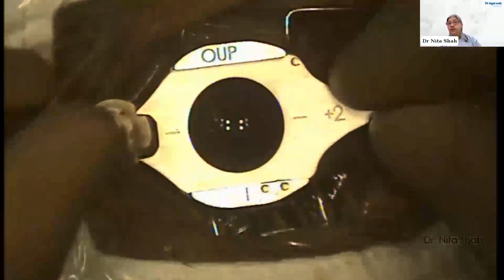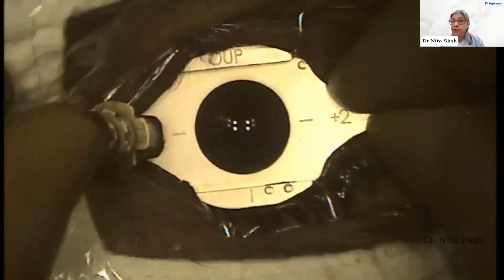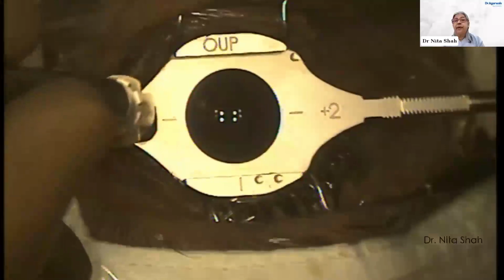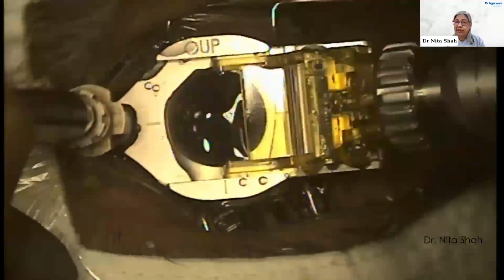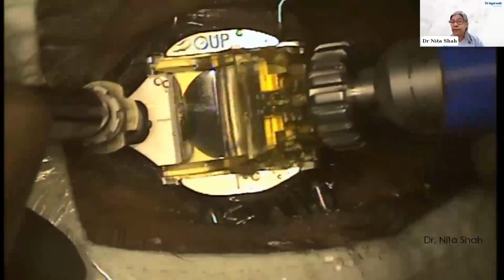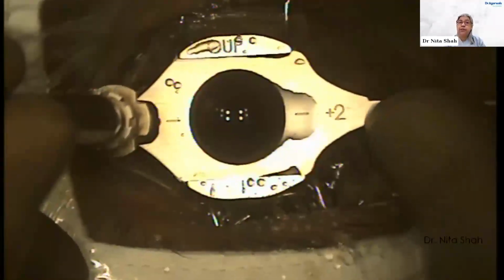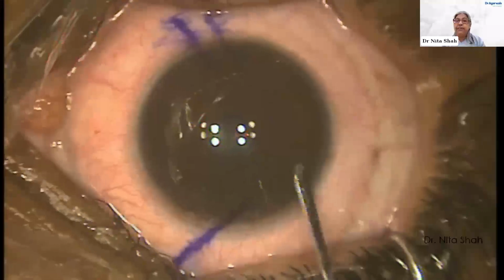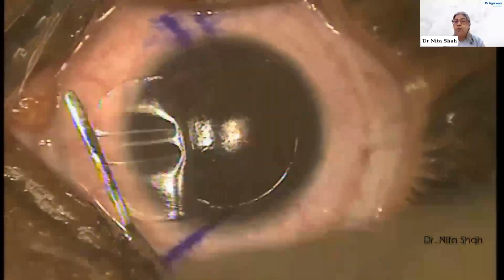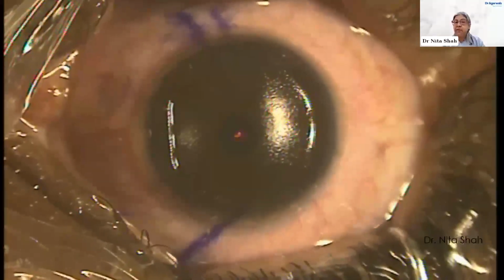Again, see, the patient is very comfortable. There is no struggling or anything, looking into the light. The microkeratome is applied onto the eye, and then the blade is moved across. Now, this same step we can do with the femto laser, which makes it a bit more comfortable, but this is over in seconds. It doesn't take more than 10 to 15 seconds to do this. And then the flap is gradually lifted again without any discomfort. The patient is able to open his eyes and keep looking at it, all done without any stitches or pain, just a slight sensation that something is going on.